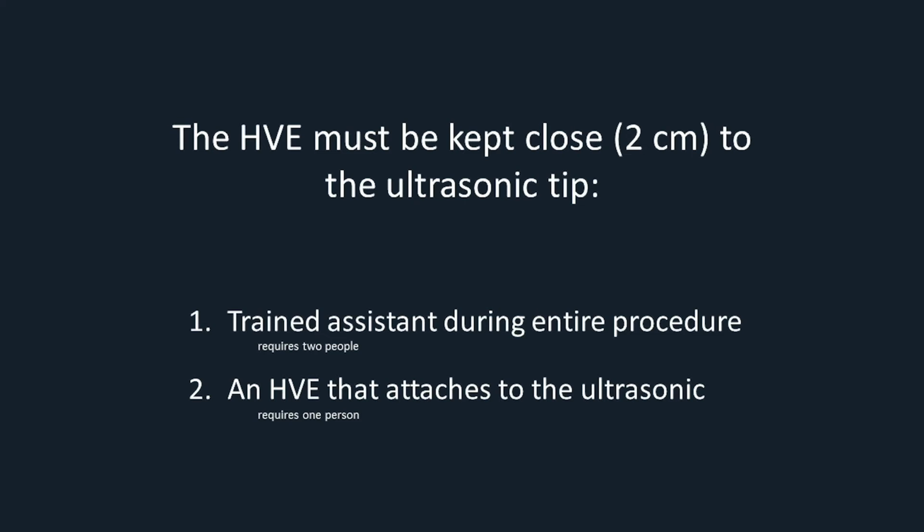The first is standard four-handed dentistry, 2 people, a trained assistant and the operator. The assistant must be trained, they must follow the ultrasonic scaler all the way around the mouth, staying 2 centimeters away from the tip. The other way is a high volume evacuator that is attached to the ultrasonic, which means that it always follows the ultrasonic scaler tip and stays the proper distance away.